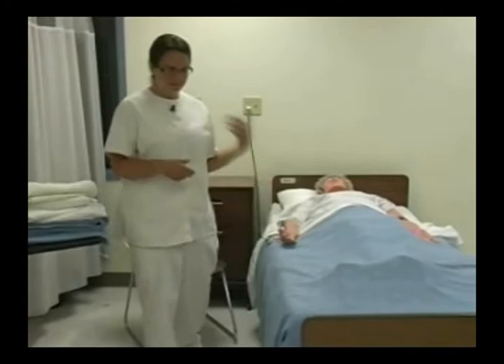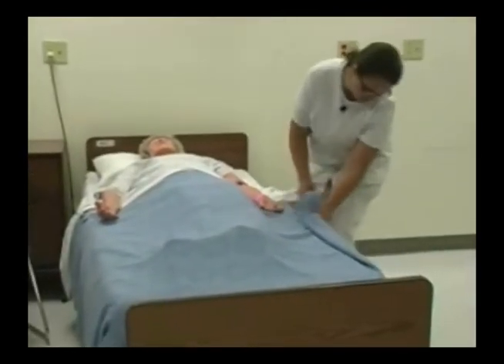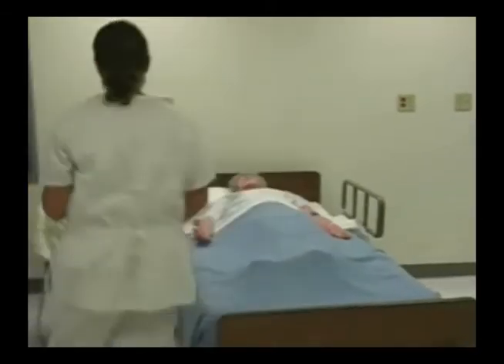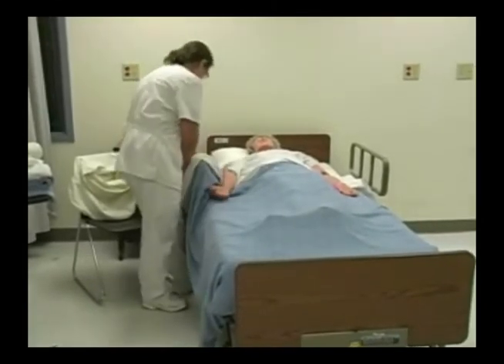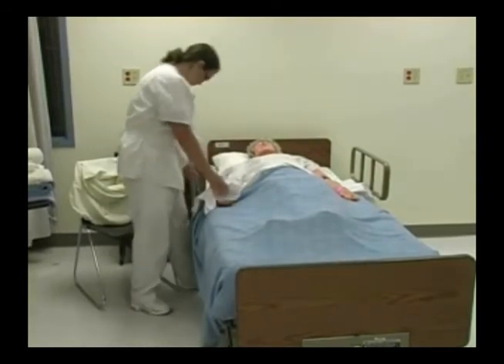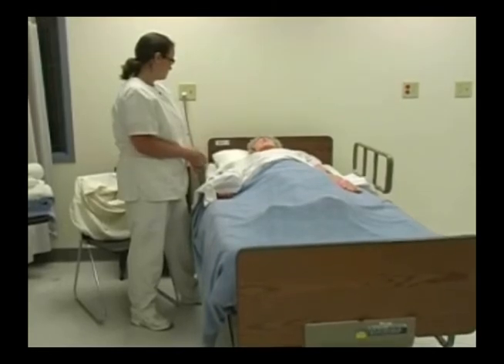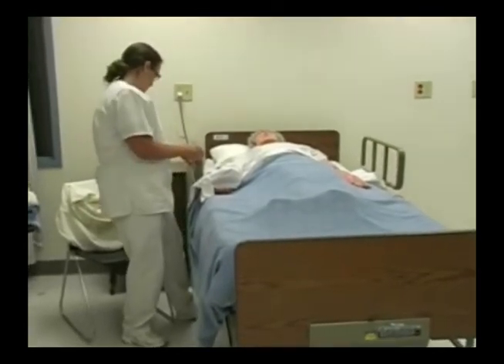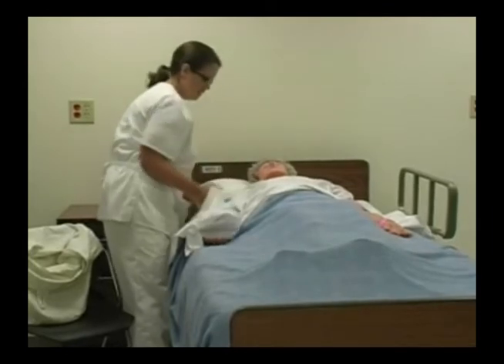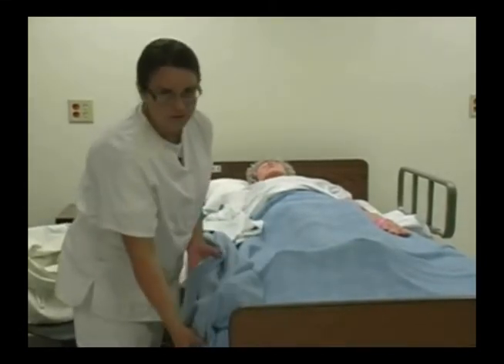I need to raise the bed to a comfortable working height. I'm going to make sure the brake is on — which it is. I'm going to raise the bed and remove the call light. I'm going to loosen the bed linens all the way around, and make sure the mattress is pushed to the head of the bed. If the linens were soiled, I would apply my gloves.